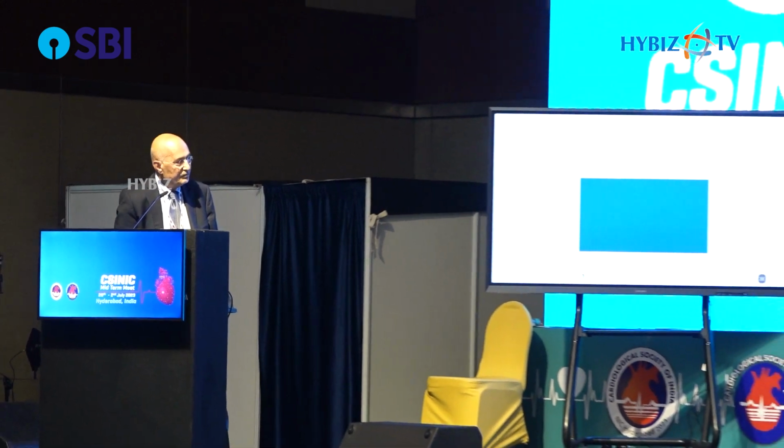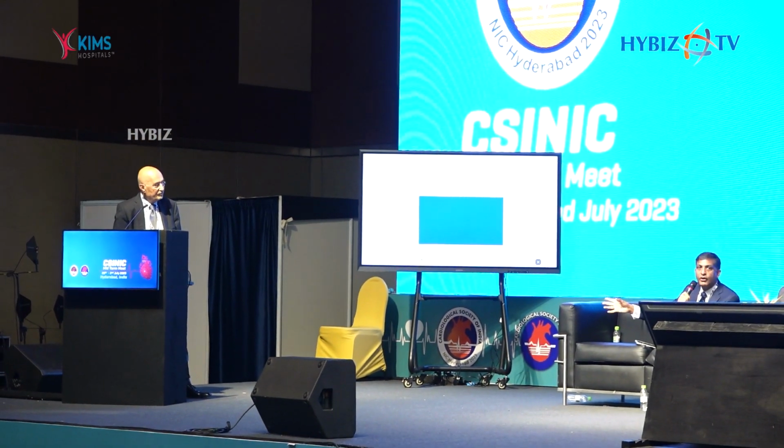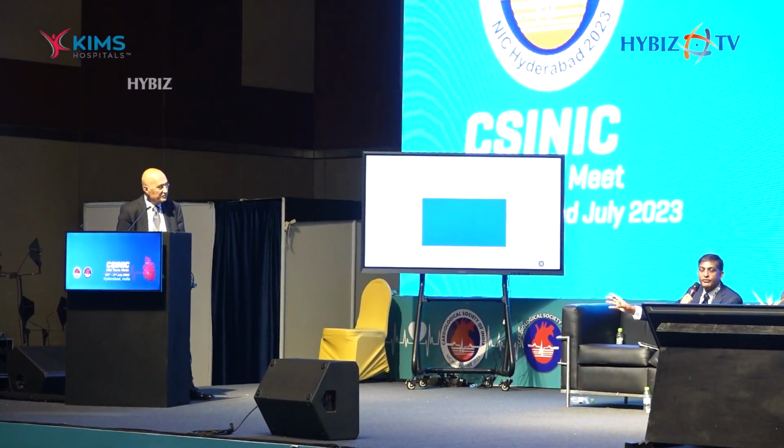DK Crush 6 looked at that, right? You were part of it. FFR versus angio-guided side branch assessment. There is no superiority of FFR-guided assessment of the side branch. I mean, if you do not have any sign of ischemia, no chest pain, and TIMI flow 3, that means you have a good flow and there is no need to touch anything.